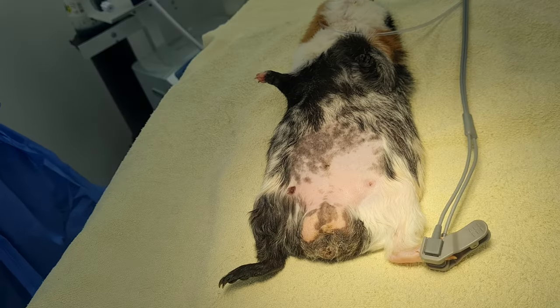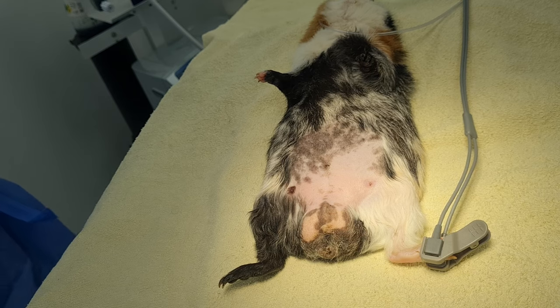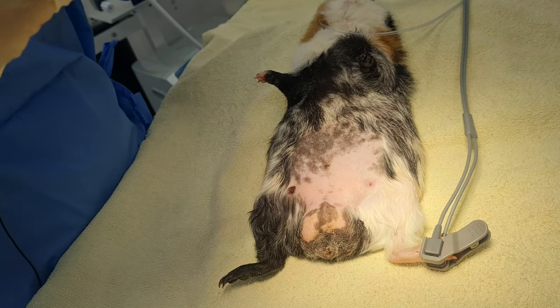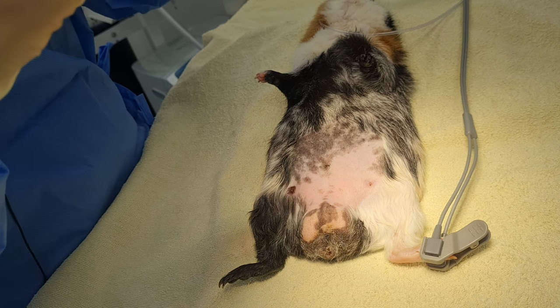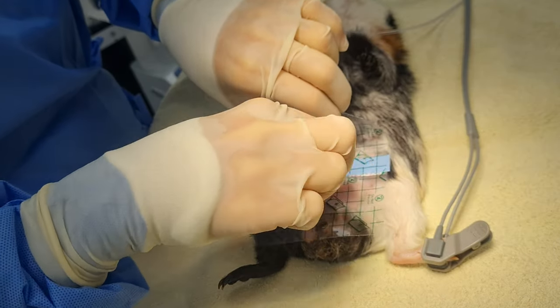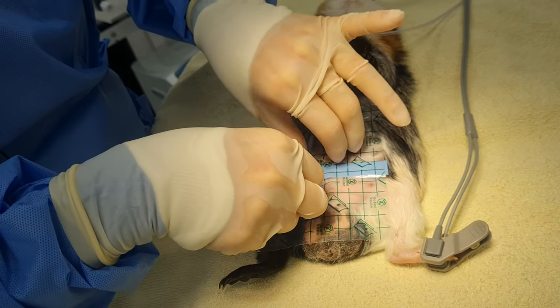This is Chip, a seven-month-old guinea pig in for castration today. We're going with a slightly modified abdominal technique. He's been clipped in a routine manner. I'll explain as we go along why we're going with the abdominal technique.